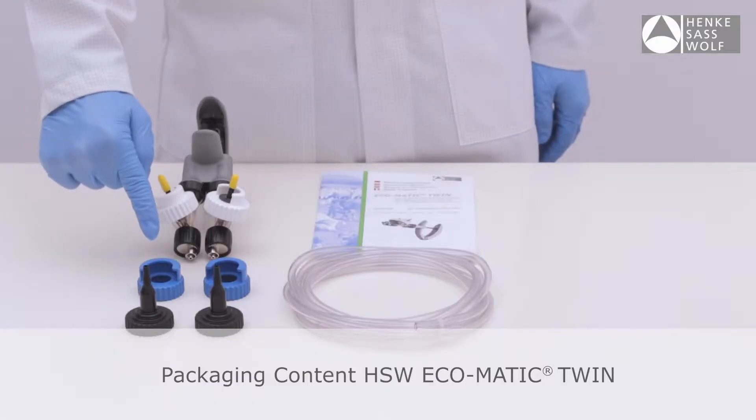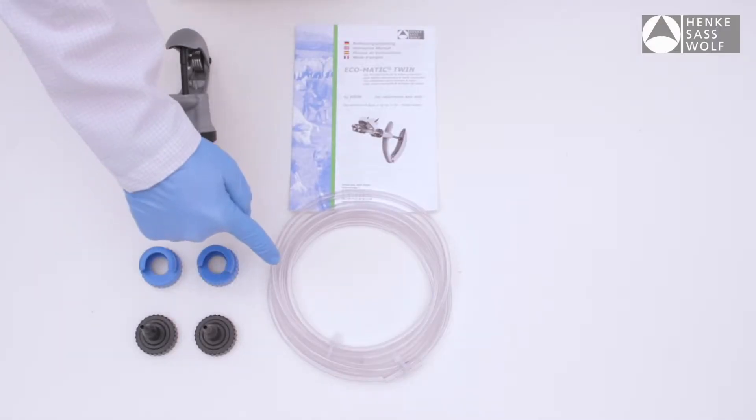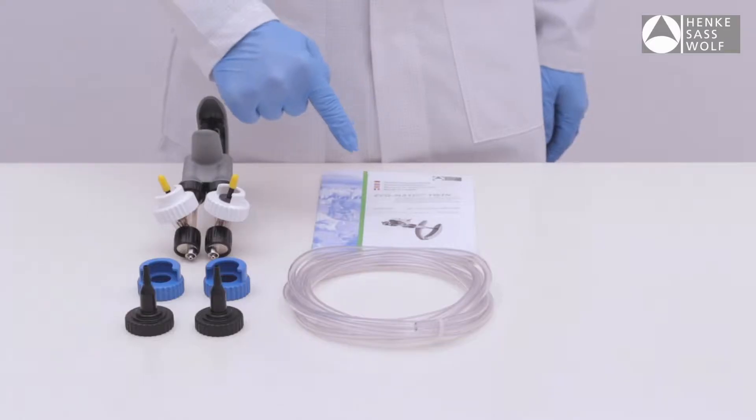Package contents include two white bottle collars for bottles with 20 mm, two blue bottle collars for bottles with 30 mm, two tubing collars, two PVC tubes, and instructions for use.